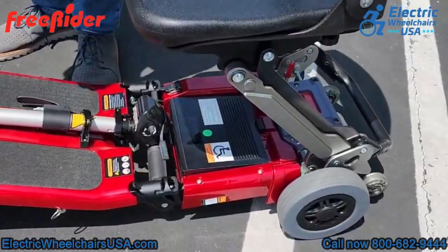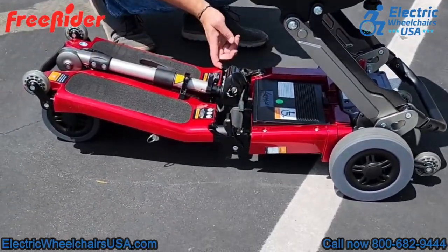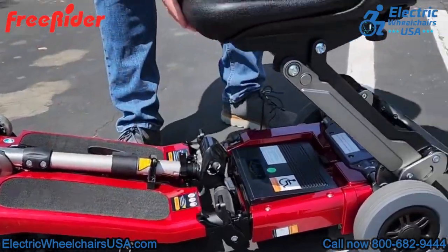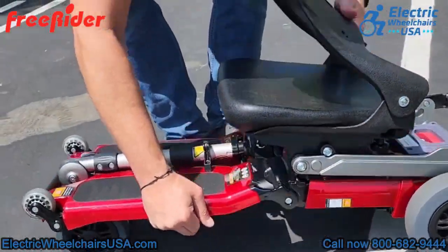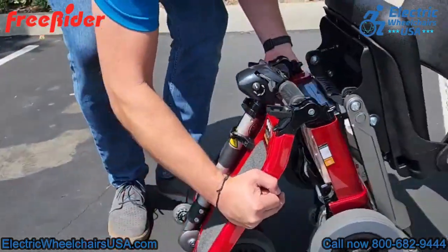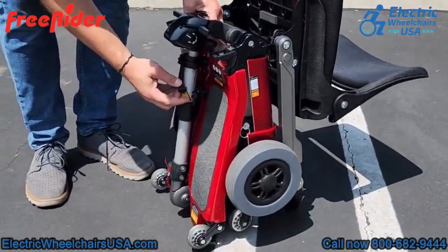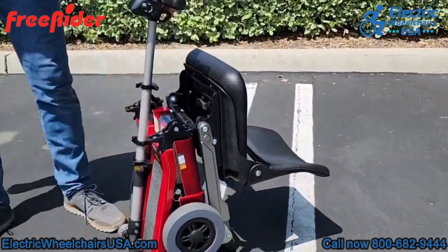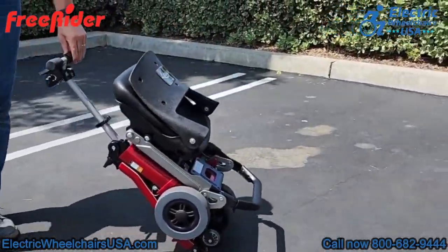To fully fold the scooter, there are two locks on the floorboard that you have to unlock. After that, press the same red button to lower the seat down — by unlocking them, you can now fold the floorboard in half for a more compact size. Once done, you can extend the tiller all the way up to the tallest position and wheel the scooter behind you like a piece of luggage.